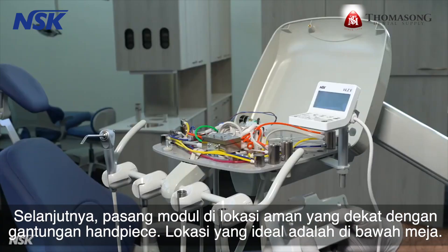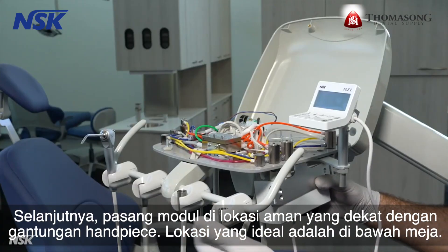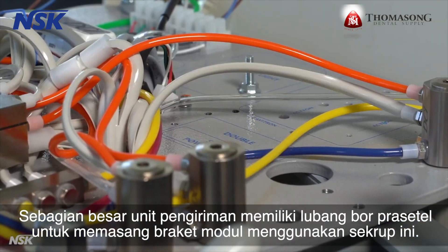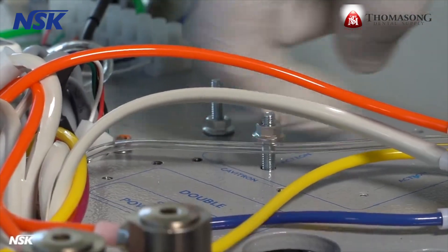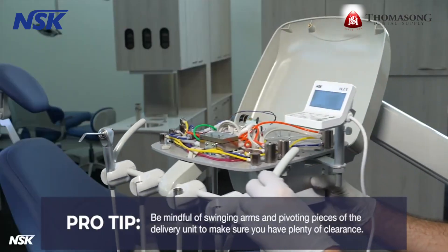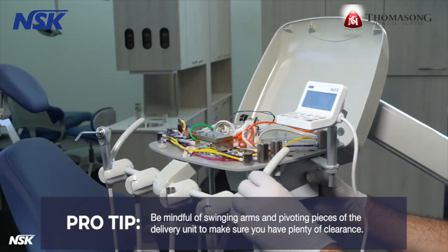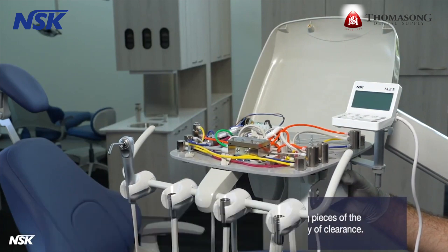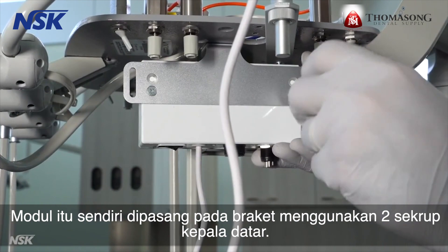Next, mount the module in a secure location that is close to the handpiece hangers. The ideal location is under the tray. Most delivery units have preset drilled holes to mount the module bracket using this screw. Pro tip: when selecting your mounting location, be mindful of swinging arms and pivoting pieces of the delivery unit to make sure you have plenty of clearance. The module itself is mounted on the bracket using the two flathead screws.